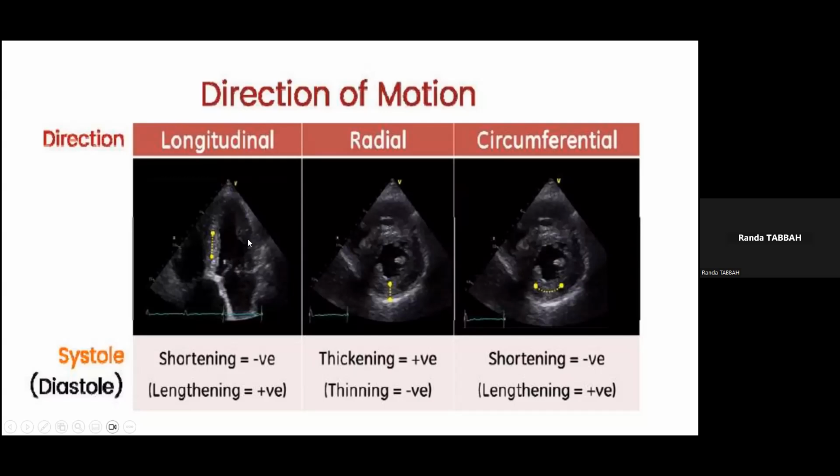It is used, for example, in patients on chemotherapy, to have an evaluation of their LV function after sessions of chemotherapy, to see if we need to stop chemotherapy when we have a decrease in the LV strain of these patients, even if the LV ejection fraction is good.